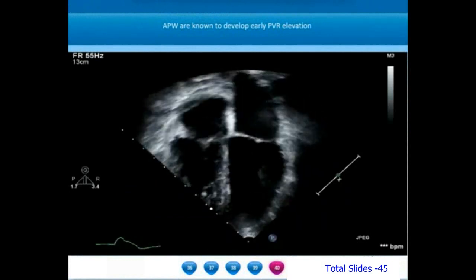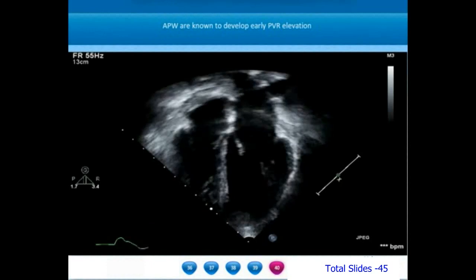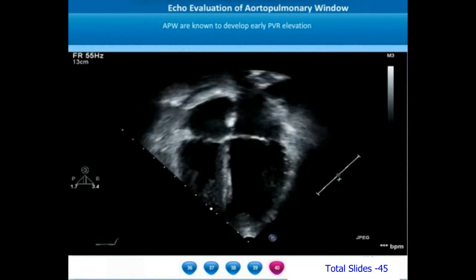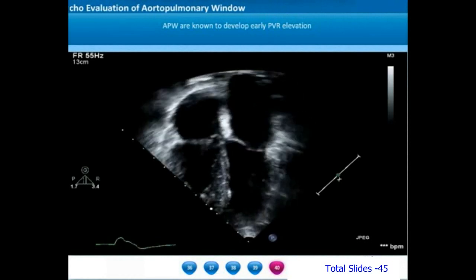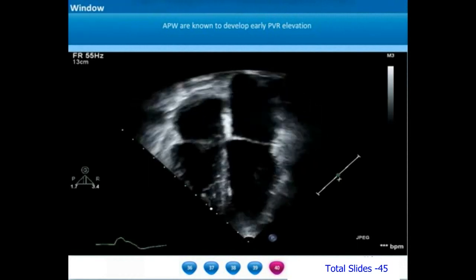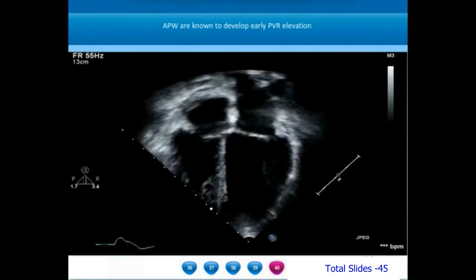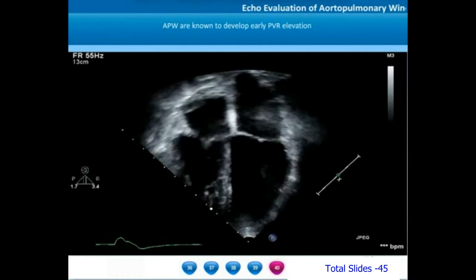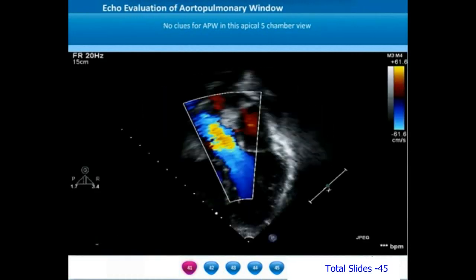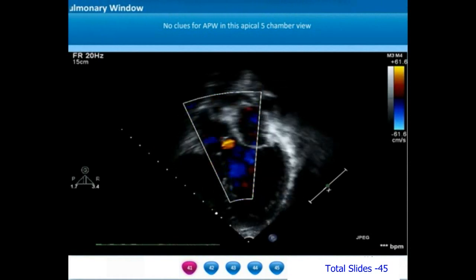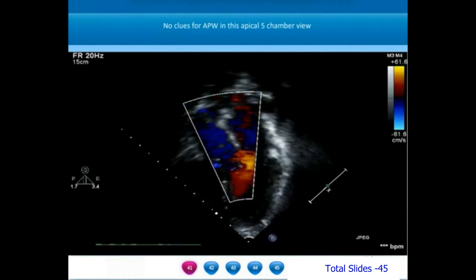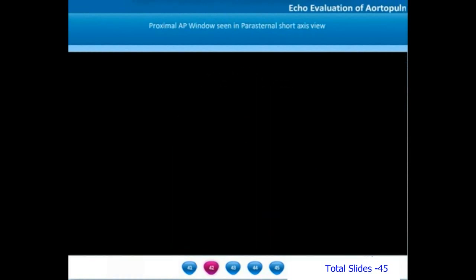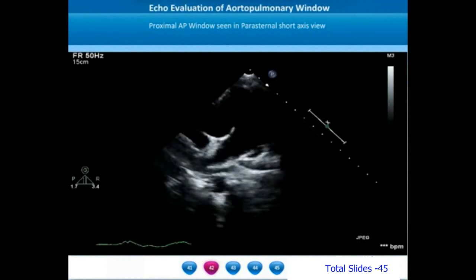Aortopulmonary windows are very notorious for early development of Eisenmenger syndrome. Among the various causes of left-to-right shunt, aortopulmonary windows are the lesions that produce very early elevation of pulmonary vascular resistance. In this example, an apical four-chamber view shows very minimal left atrial and left ventricular dilatation. On an apical view sweeping anteriorly, the left ventricle continuing as the ascending aorta is seen, with no obvious clue towards the presence of an AP window.